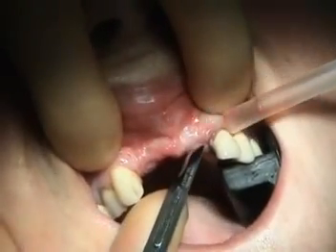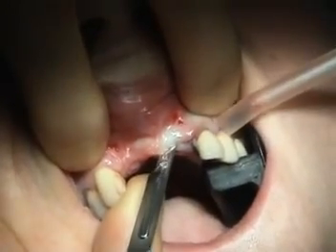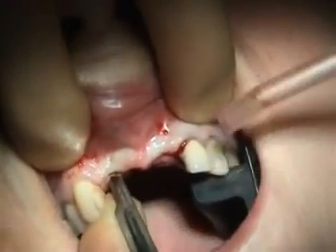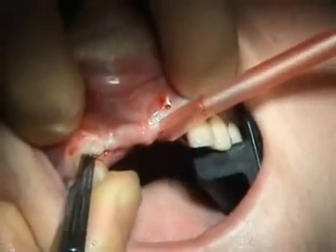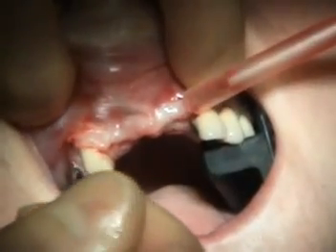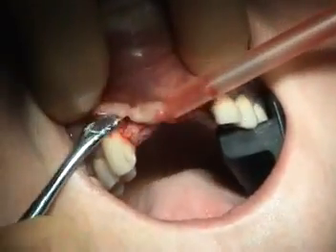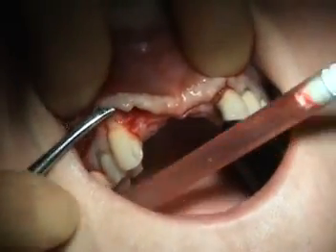Surgery is being carried out under local anesthesia and intravenous conscious sedation. A full-thickness mucoperiosteal flap is being raised using a standard number 15 surgical blade. A Molt periosteal elevator is used to carefully raise the full-thickness flap.